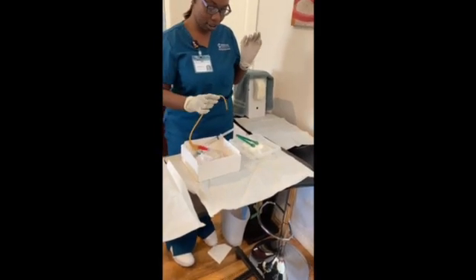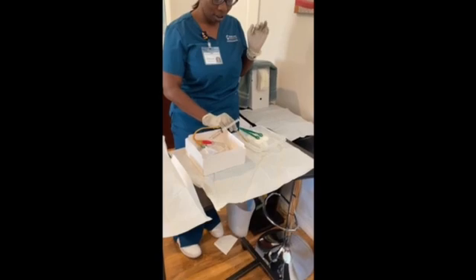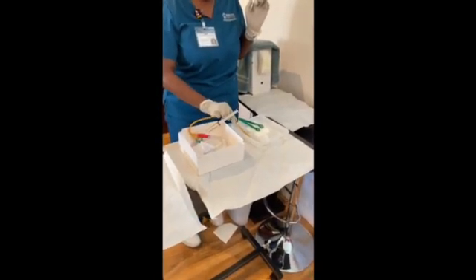You want to make sure that you lubricate the first 1 to 2 inches of the catheter by rolling it around in the lubricant.